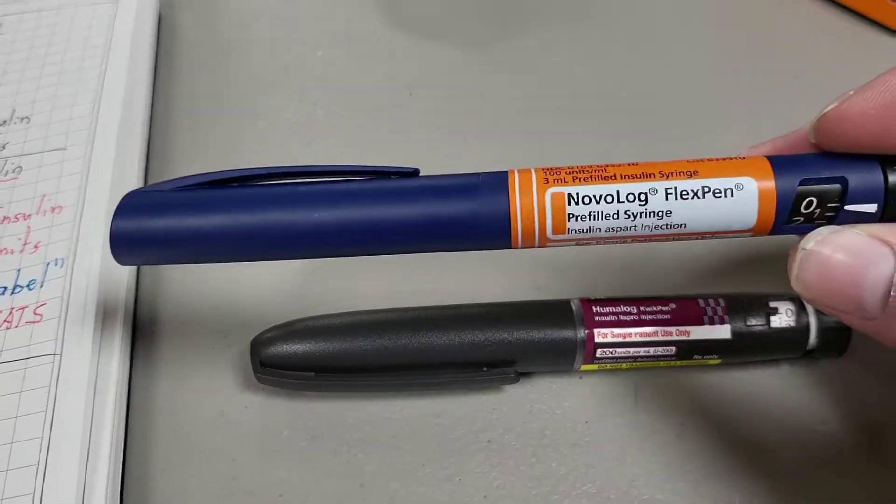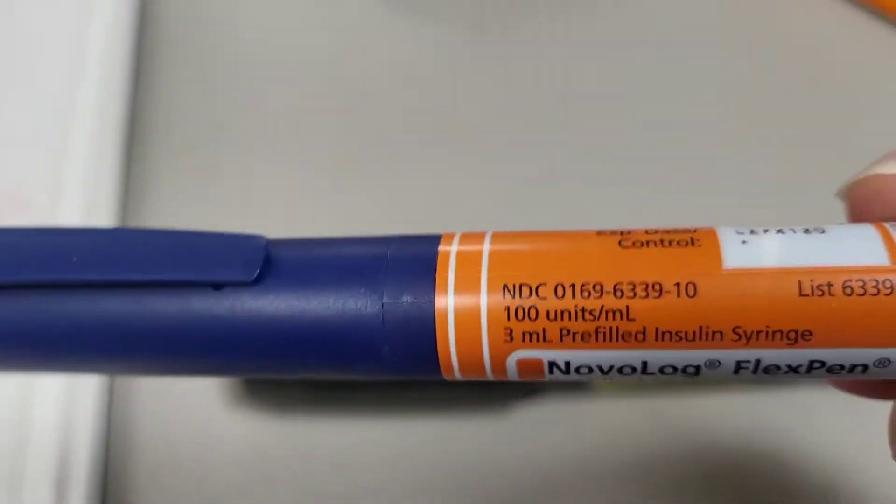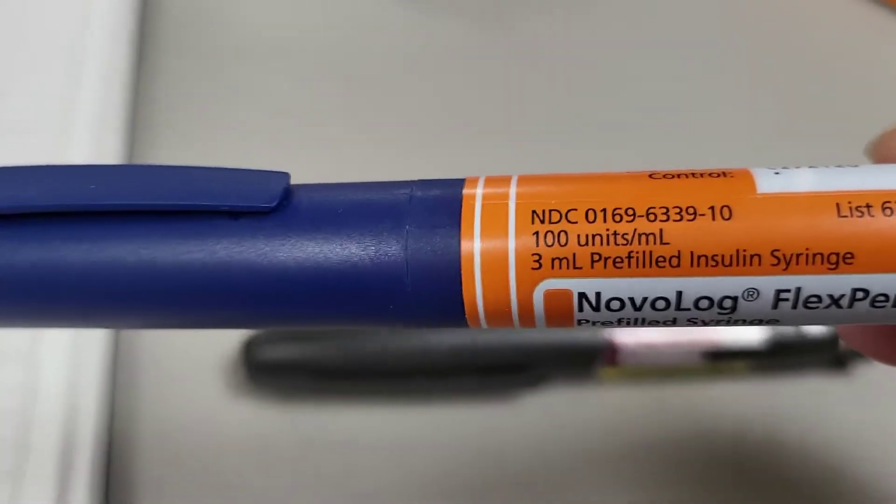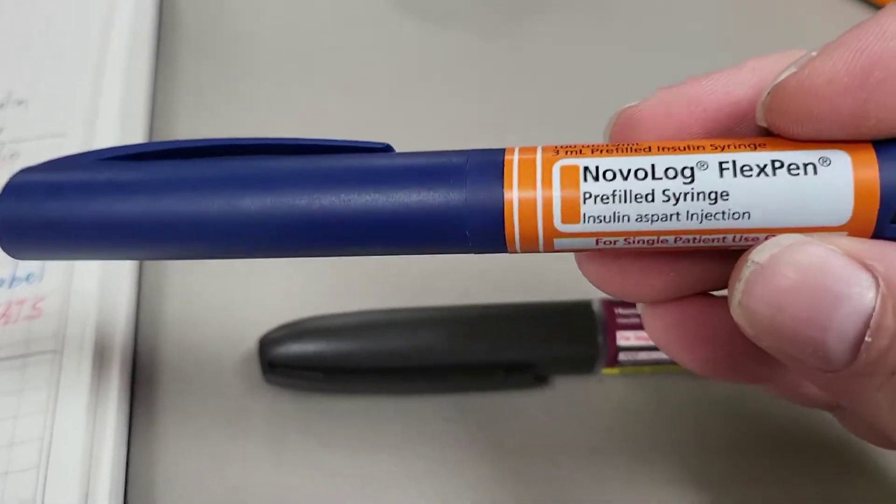This here is NovaLog, contains three milliliters of insulin, and there are 100 units in each of those milliliters, meaning each pen contains about 300 units.